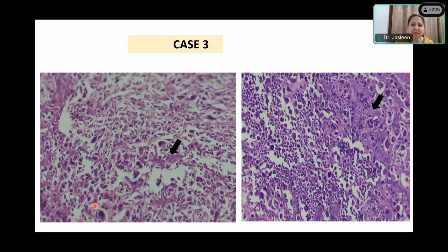From ribs. From bone. Yes, from ribs. Okay, underlying bone, one, two. Somebody rightly put in the chat box, they said metastasis. Okay, osteosarcoma elsewhere, metastasis. And third, there is no osteosarcoma elsewhere. All the bones are okay. The underlying ribs are absolutely normal. Can we still have an osteosarcoma?